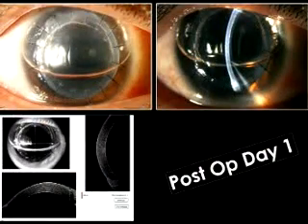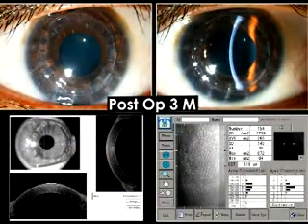Postoperative pictures with anterior segment OCT on day 1 showed good graft attachment. At 3 months, patient regained a visual acuity of 20/30.